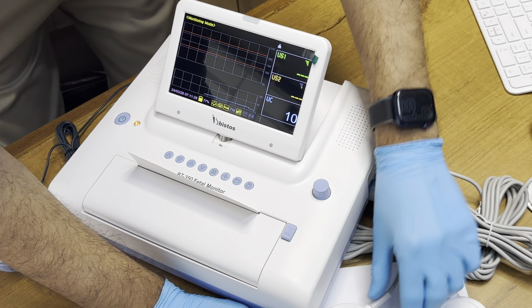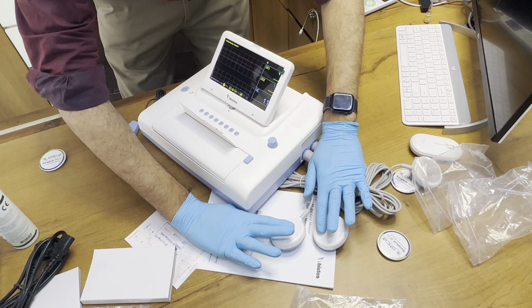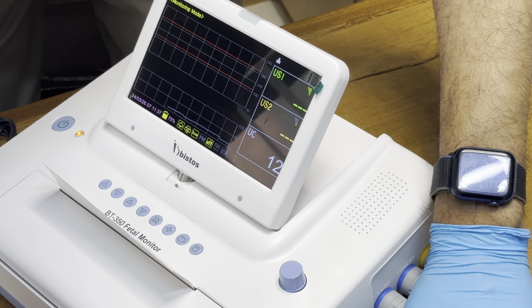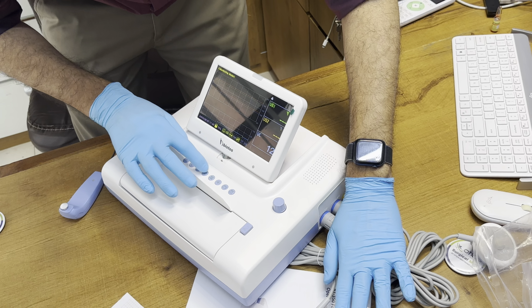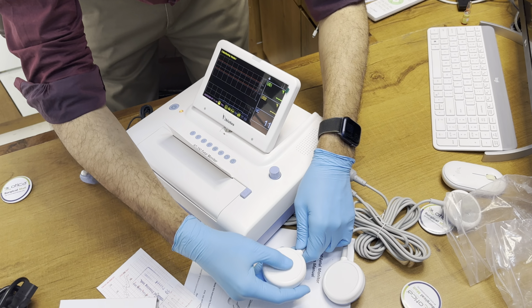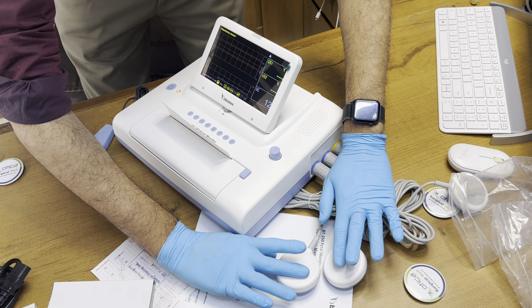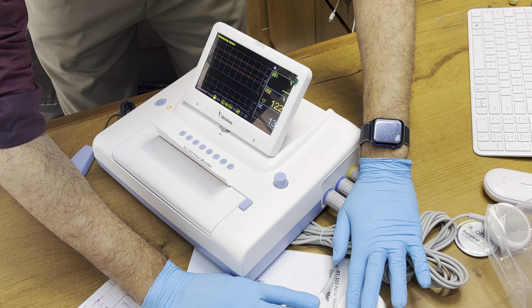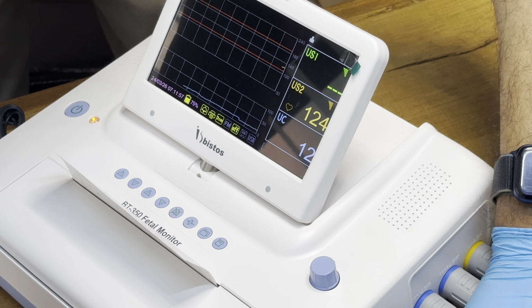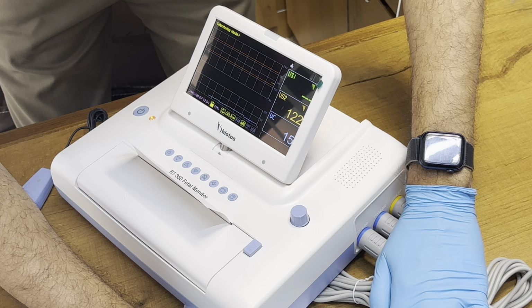Now to test this, we will just tap it, as we don't have a patient right now here. You can see, if you tap it like this, it will give you the graphs. We are just increasing the volume so you can hear. So we need to tap it like this. You can see it has given the graph, and it has also started printing it. So this is just a test we are doing.